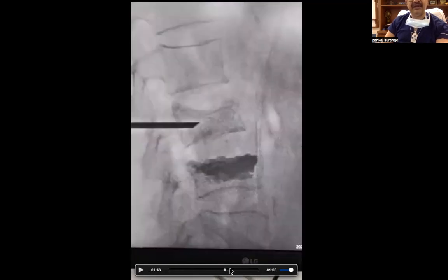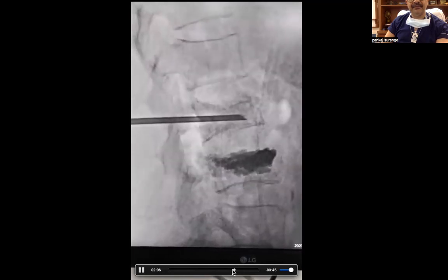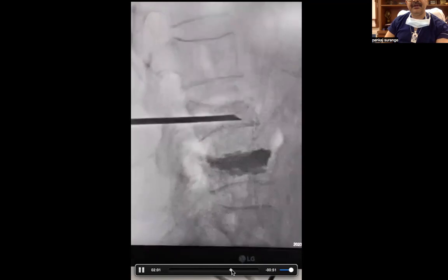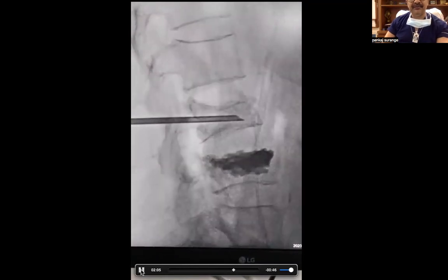And this is the second upper level. You can see that's a very simple case. You can go with this. So don't worry about this. There's something here. Okay, don't worry about this. This is not a cement leak, because this is cement which is outside the body. There was some cement outside the body, lying there, so I just removed it so that there's no confusion.